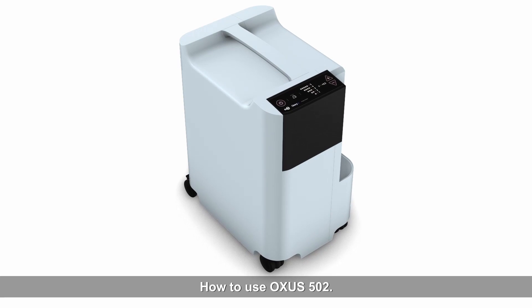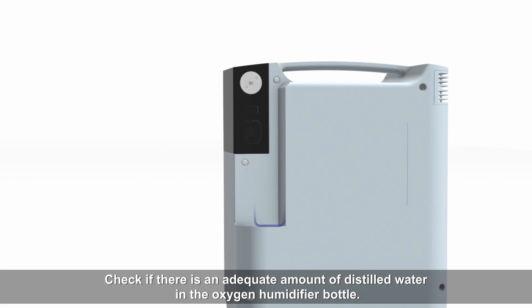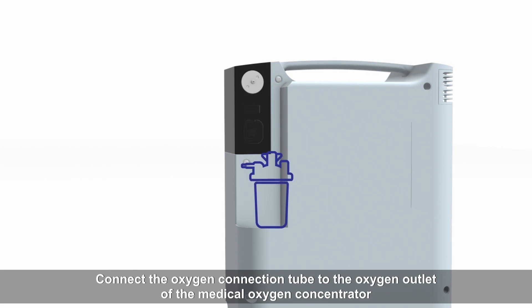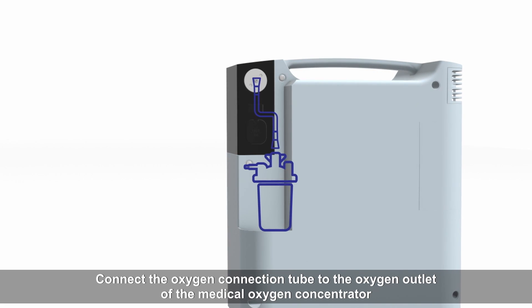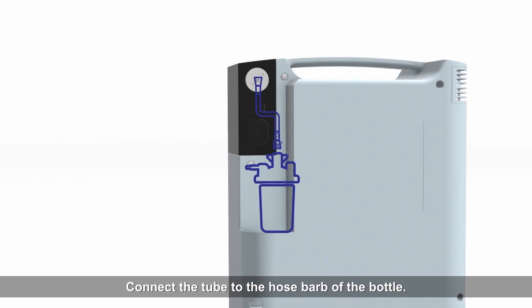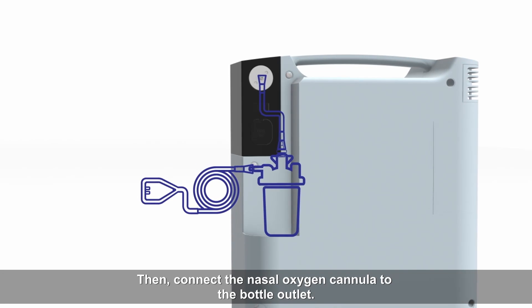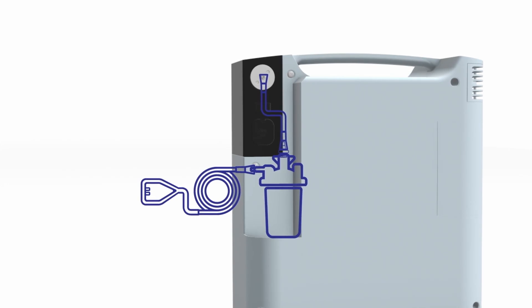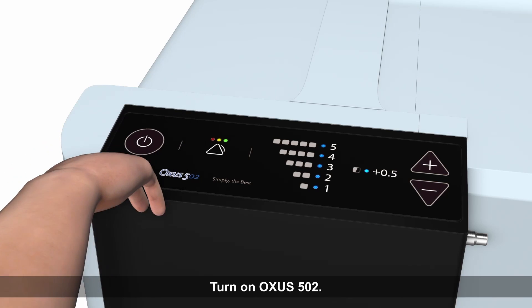How to use Oxys 502. Check if there is an adequate amount of distilled water in the oxygen humidifier bottle. Connect the oxygen connection tube to the oxygen outlet of the medical oxygen concentrator. Connect the tube to the hose barb of the bottle. Then, connect the nasal oxygen cannula to the bottle outlet. Connect the plug to an outlet. Turn on Oxys 502.